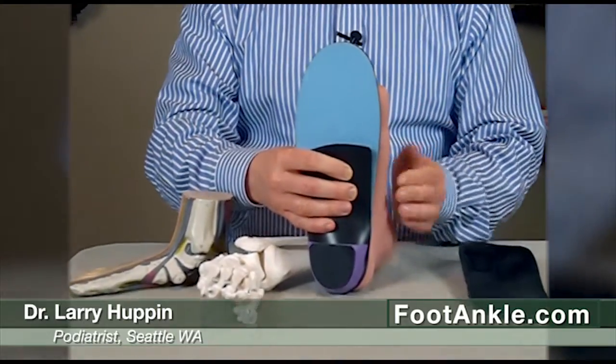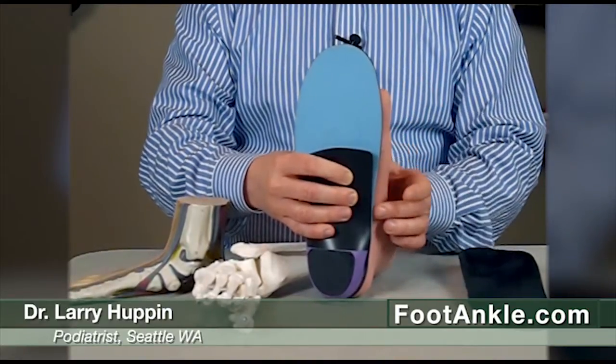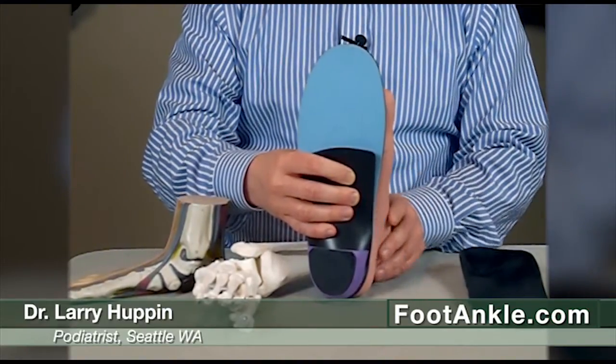So here are these people that really need orthotics almost more than anybody out there, and yet they cannot tolerate standard orthotic devices. They're just not comfortable.